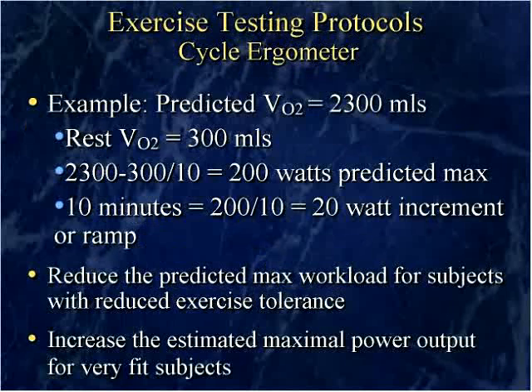And that can have a tremendous impact on the overall exercise, because Wasserman and Hansen published a paper way back in the 1980s that stated that the optimal length of an exercise test is somewhere between 8 to 12 minutes. And so that's usually why I target 10 minutes. That way they can focus in on exercise. We get enough data to process and analyze, but yet they're not exercising for 25 or 30 minutes and just becoming fatigued rather than focusing in on where they're going to go from there.